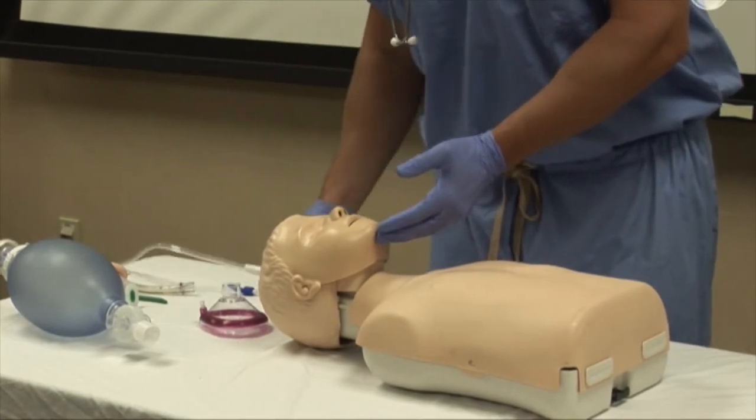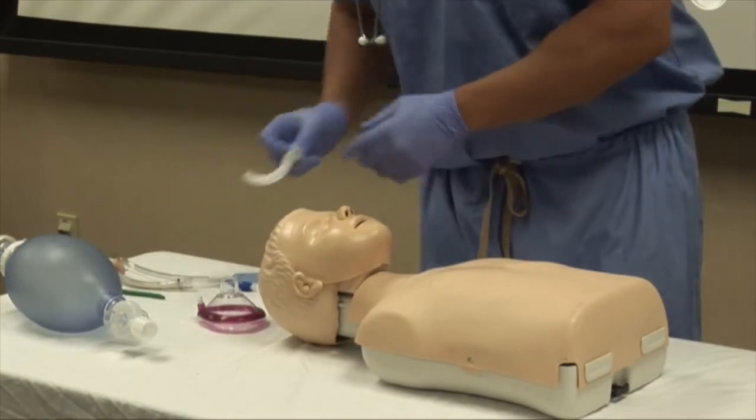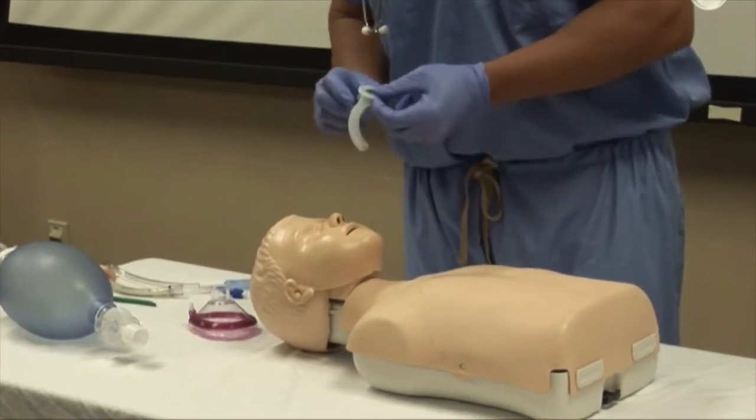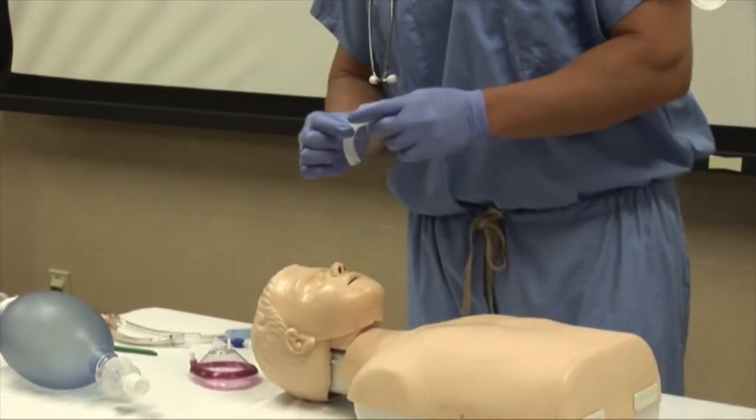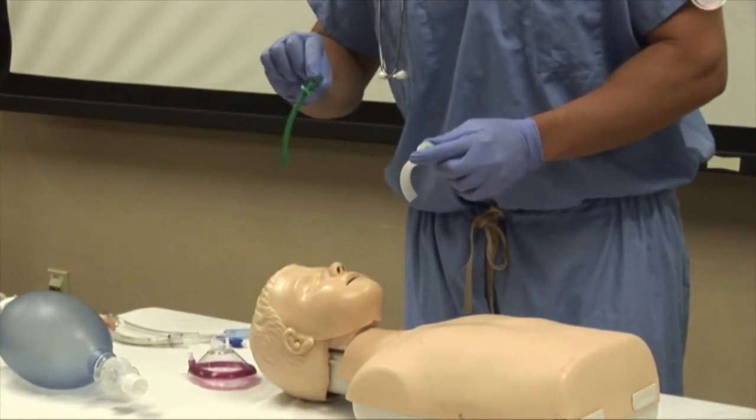Now that the airway is open and clear, consider a couple airway adjuncts to maintain patency. There are two main types including the oropharyngeal airway for unconscious patients and the nasopharyngeal airway for conscious patients.